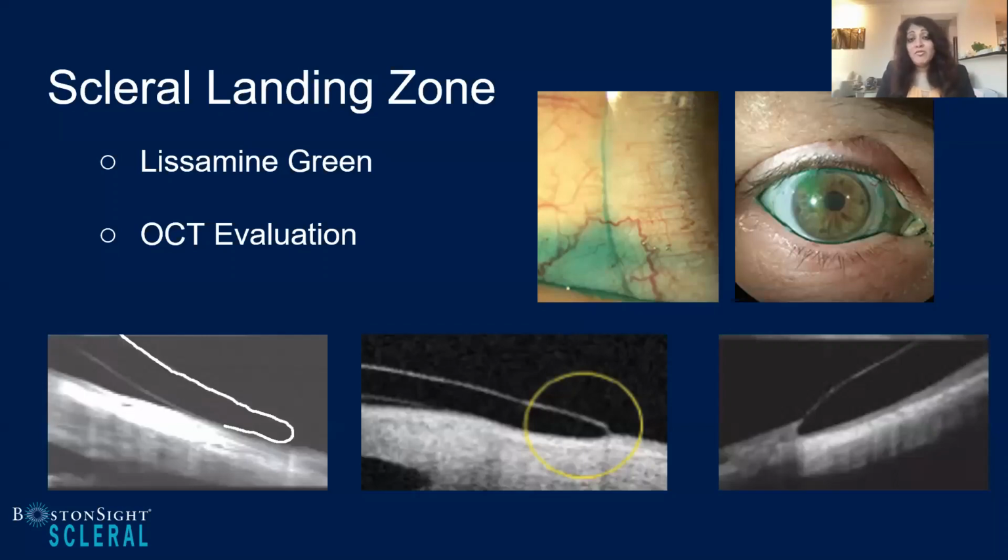A key point that you've mentioned is about looking at the conj, taking the lens off, and putting dye, whether it's fluorescein or lissamine green, onto the cornea and onto the conj, so you can see what is actually happening underneath the lens, and if that lens edge is creating any irritation or causing any problems to the conj. If you don't take that lens off and take a look, you're not going to be able to find some of the issues that arise. Last thing to take a look at here is the OCT. The OCT is really helpful for you to be able to take a look at that edge, whether the edge is lifting, whether it's really diving in, or whether you have that nice landing.